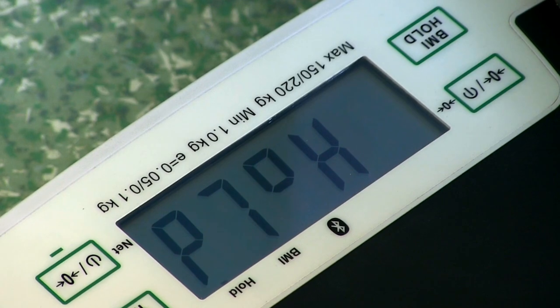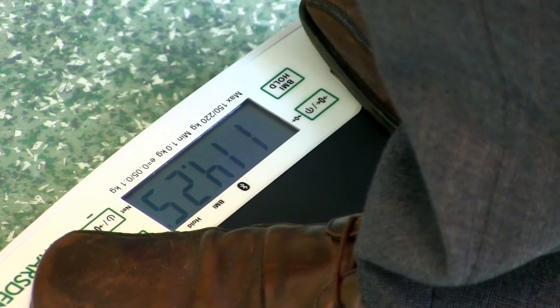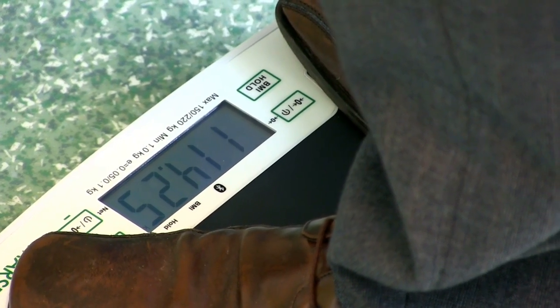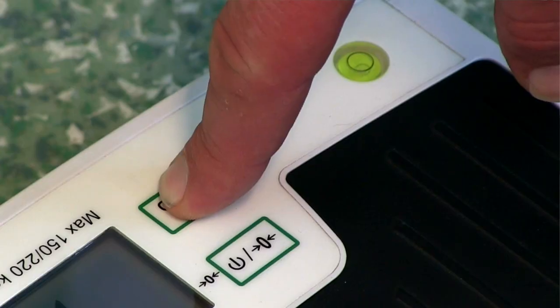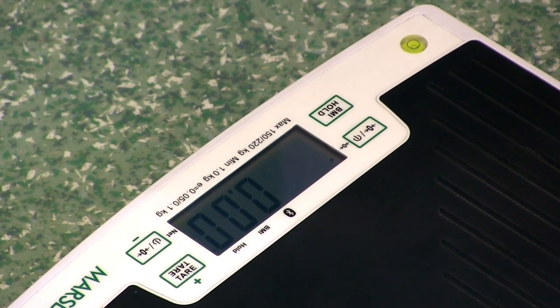Have your patient stand on the scale. The hold weight will find the patient's weight and hold it there for you, meaning the patient can then stand off the scale, giving you ample opportunity to make a note of that patient's weight. To disable the hold function, press the hold button again and the scale goes back to its normal weighing mode.